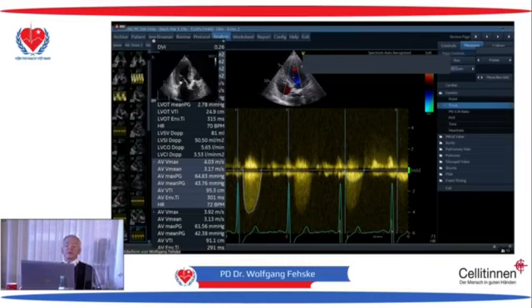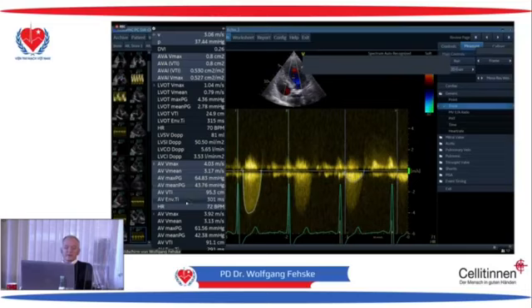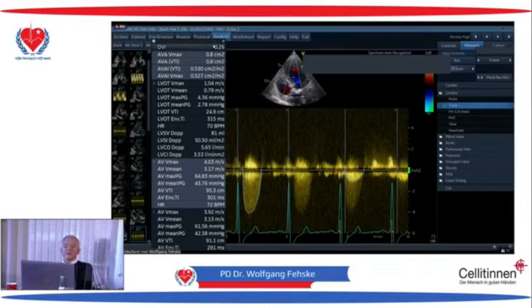And this shows me now, because I've given in the LVOT diameter somewhere else, I don't know where exactly, before, because I did the examination already yesterday, and it calculates directly from V1 to V2 the Vmax. It gives in this case the same as VTI. I tried to explain it this morning. It is a severe, per definition, aortic stenosis.